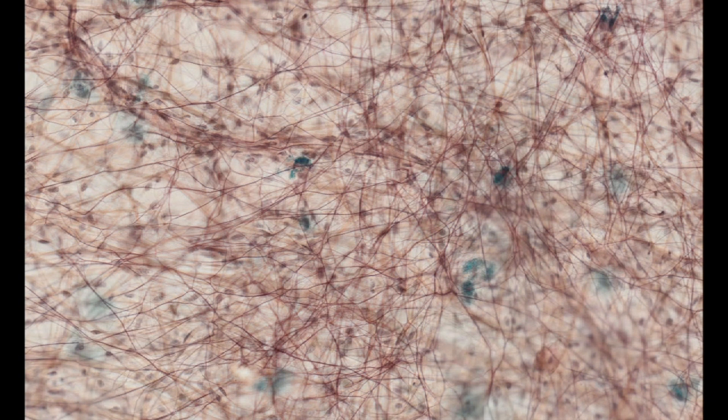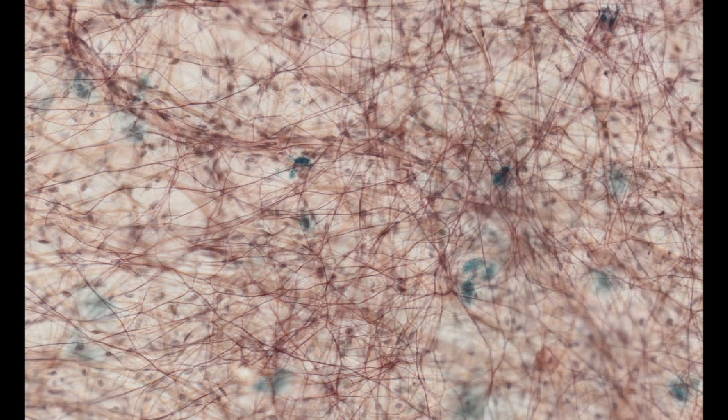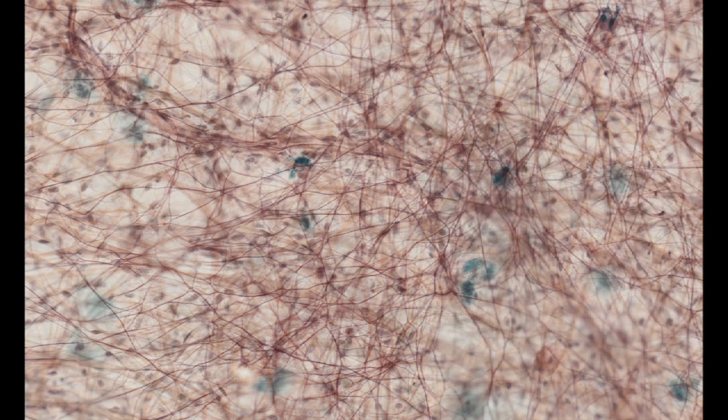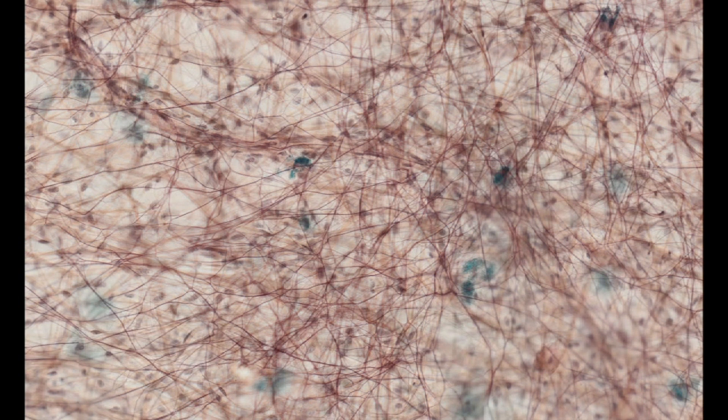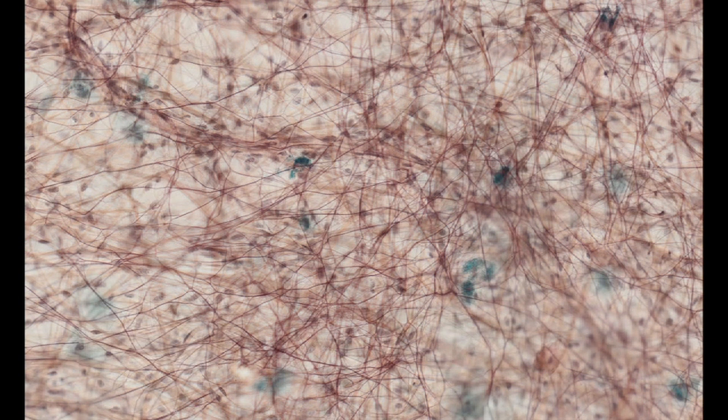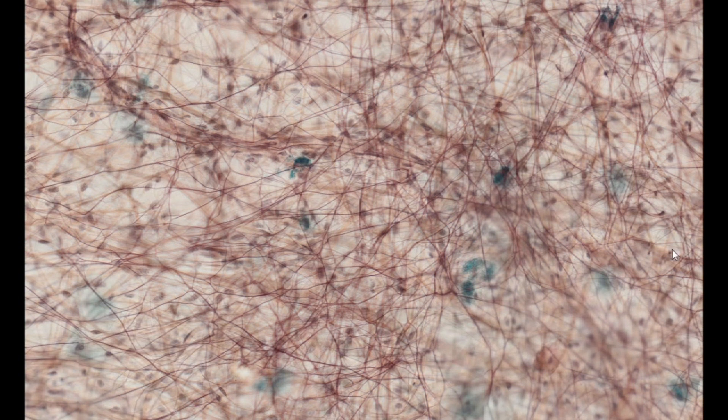Loose connective tissue, orcine and toluidine blue staining. The specimen shows loose connective tissue proper in orcine stained mesentery. This tissue fills the spaces between elements that make up organs and tissue, as well as introduces blood vessels, lymph vessels and nerves into organs. It is characteristic of the subcutaneous tissue, the lamina propria of the mucosa and submucosa, as well as mesenteric serous membrane, which can be seen in the specimen.